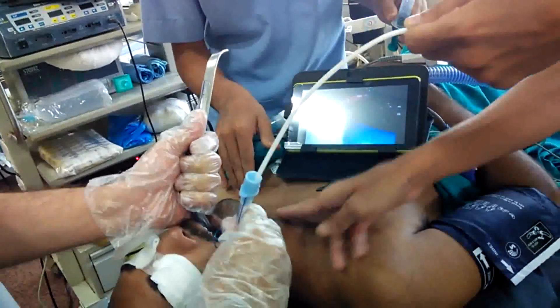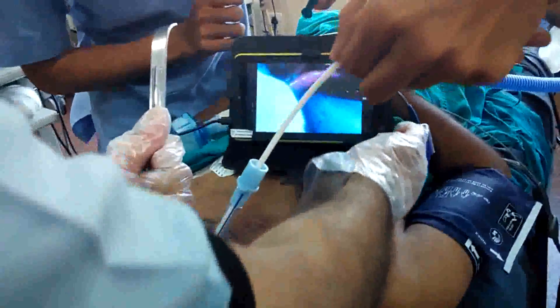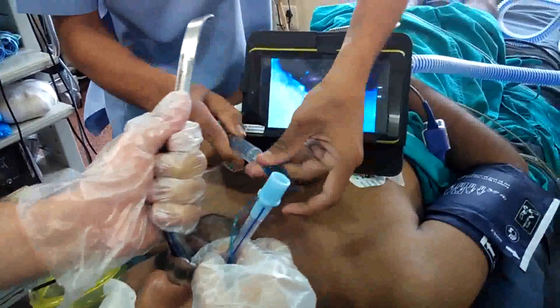The tube has entered inside. I am taking the laryngoscope out.